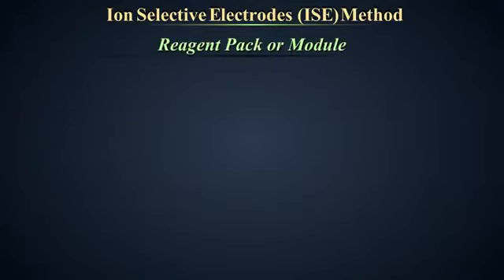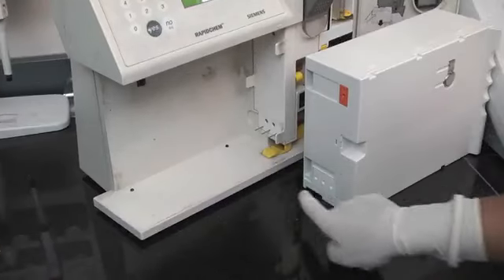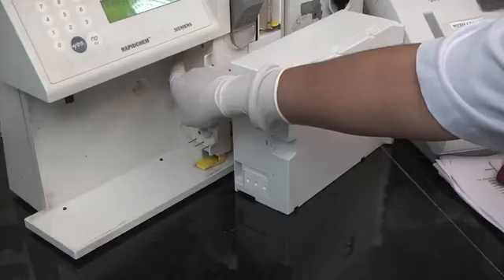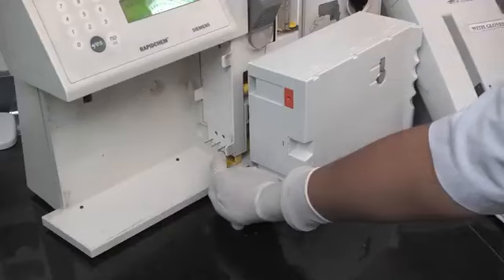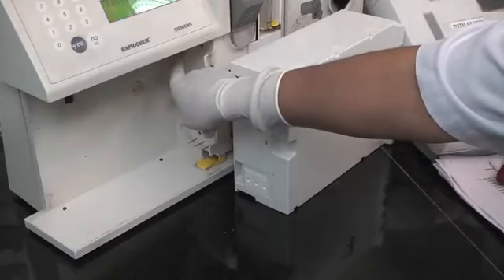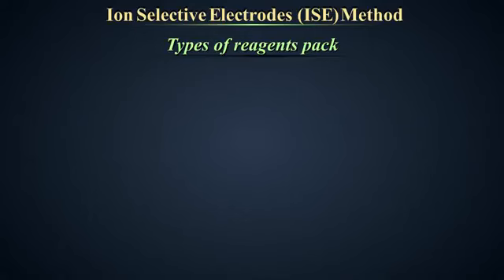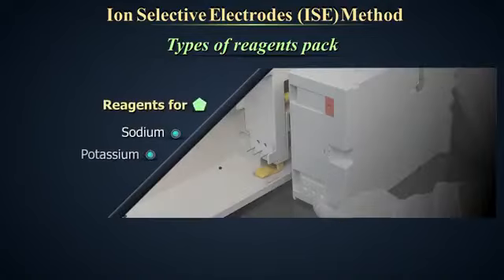Reagent pack or module. The reagent pack is a rectangular box which stores the reagents in the lower half and the waste is generated in the upper half. The left side of the pack has 3 inlets for the reagent tubes on the main body of the analyzer and also 1 inlet for the waste generated. 2 types of reagent packs are commonly available. One with reagents for sodium, potassium, and chloride, and the other with reagents for sodium, potassium, and lithium.